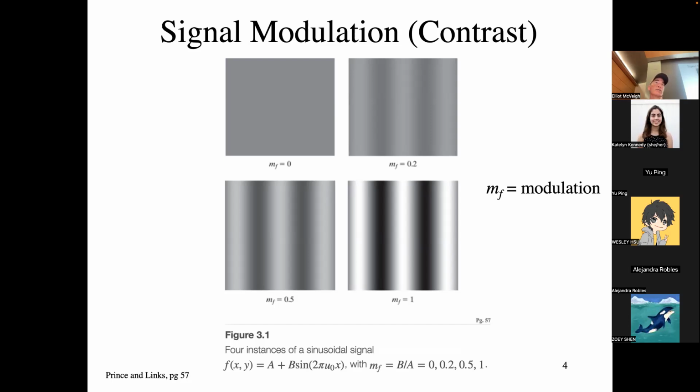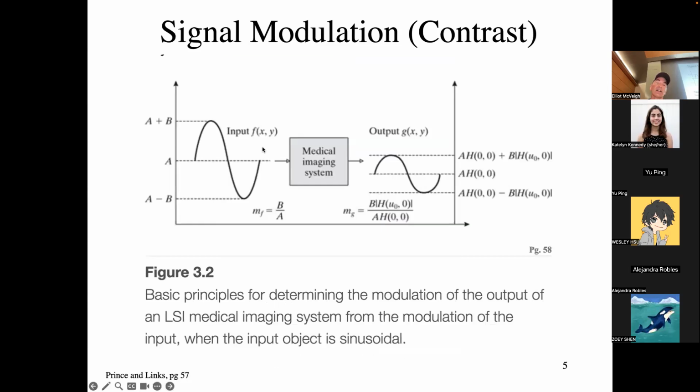And what we're going to find out is that we can build any picture we want by adding up sine waves of different frequencies and different amplitudes. And for a two-dimensional image, these sine waves will have a frequency, an amplitude, and they'll have a direction, right? So they can go diagonally, vertically, horizontally, etc. So we have those degrees of freedom to build a two-dimensional function. The interesting thing about characterizing quantitatively what an imaging system does to a signal, we can also boil that down to a very basic behavior.